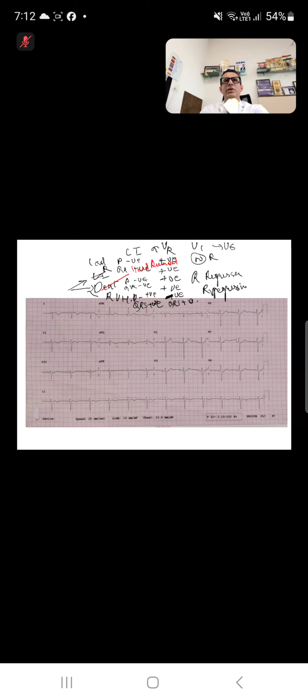Yeah, so chest leads, actually one of the good practices is to mark where exactly you are putting the chest leads and always take the chest leads in that position. Because one day one nurse will take in one position and another day another nurse will take in some other position. So that is something which can happen. But what other things are there here?